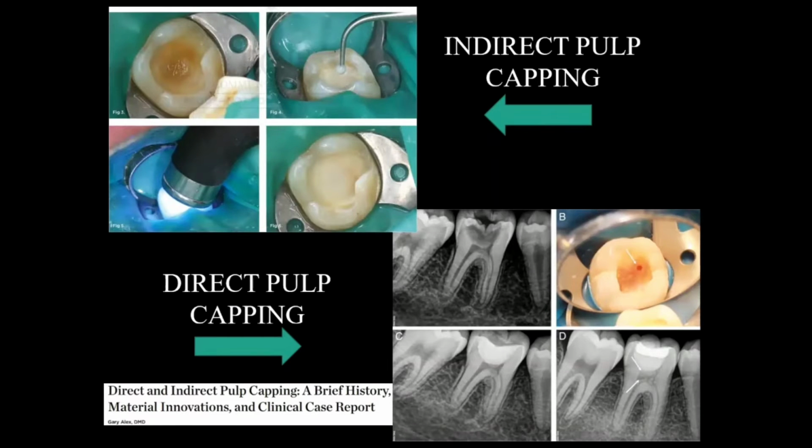In indirect pulp capping, all carious dentin typically is removed from the walls and the dentino-enamel junction of the cavity preparation. A layer of deep carious lesion, which is usually discolored but firm, may be left on the floor of the preparation if its removal may cause a pulpal exposure.